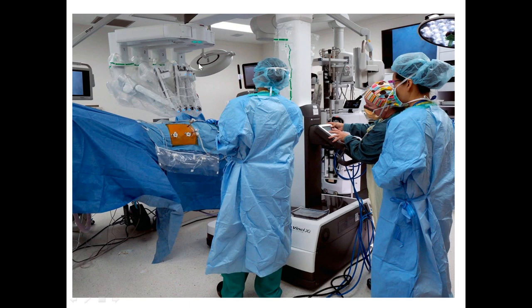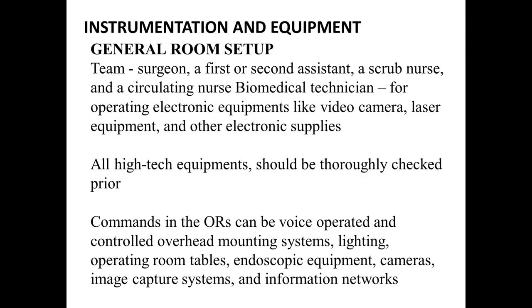So now the cost of the robo is also getting added to the minimal invasive surgery. So what is the difference between open and minimal invasive? It's pretty costly. It's very, very precise though, and it is aided by the gadgets. With that, I'm just going to mention the minimal invasive surgery equipment.